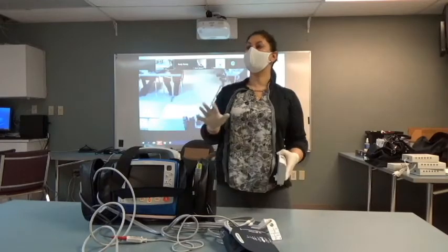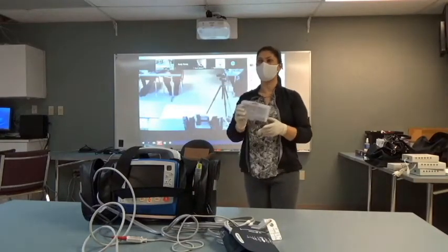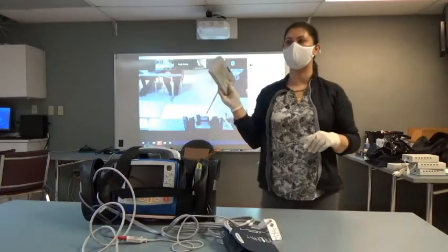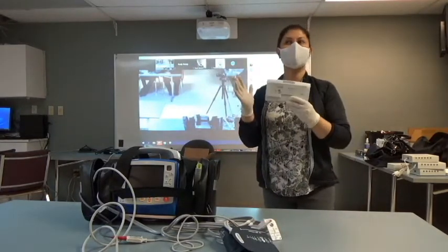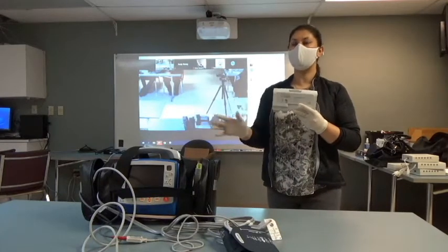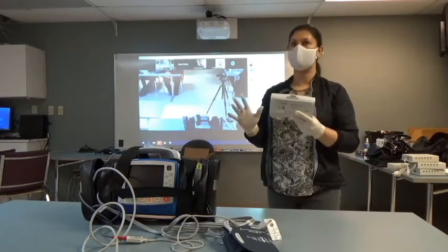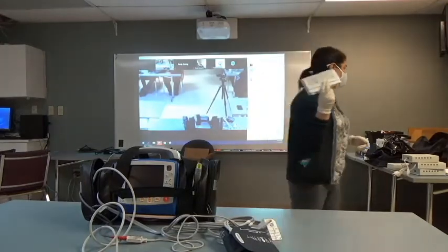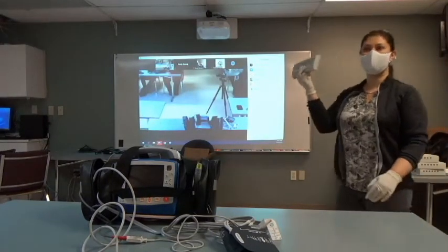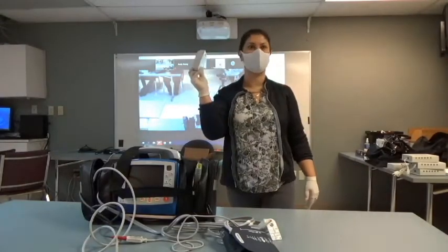Okay. So that's okay. One thing I just want you guys to keep in mind is these batteries are sealed lithium ion batteries. So these things need to visit a base charger at some point. Okay? So your department will come up with a rotational schedule, and there's a base charger up front here. It'll have to visit that base charger whenever that rotation is.